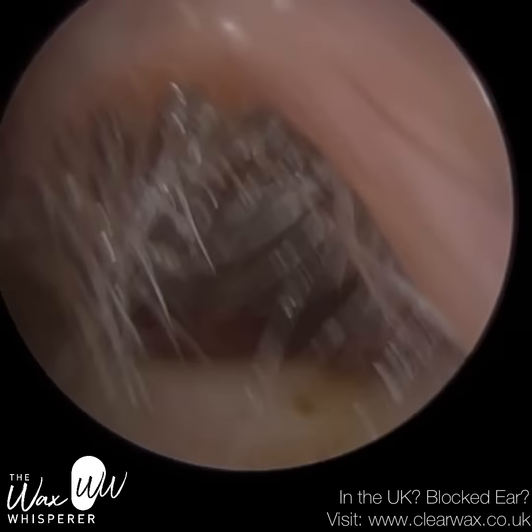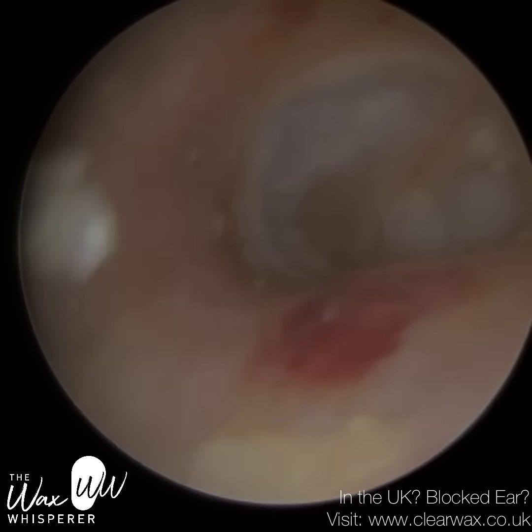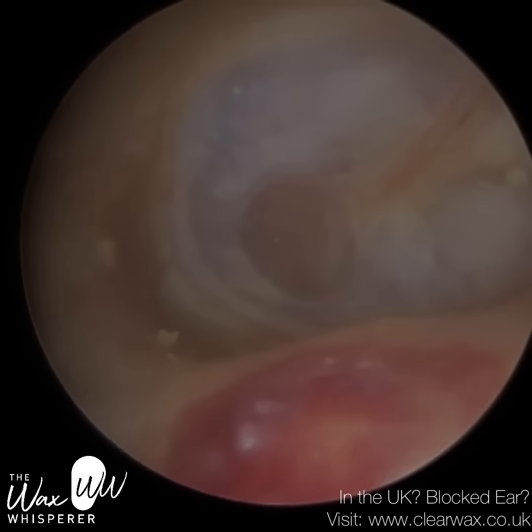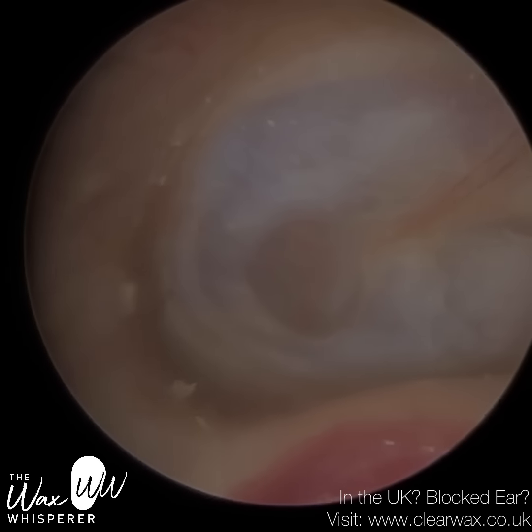So the eardrum's intact, a bit opaque — some tympanosclerosis. Now, this is their right ear. You can see they've also been using a cotton bud in the right. There's no earwax there.